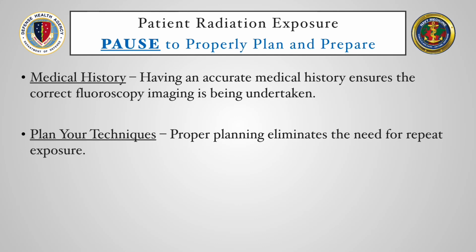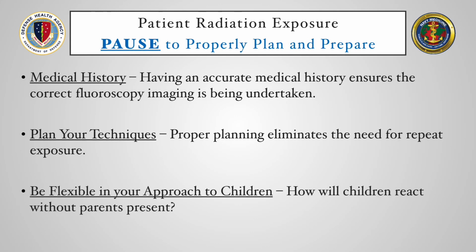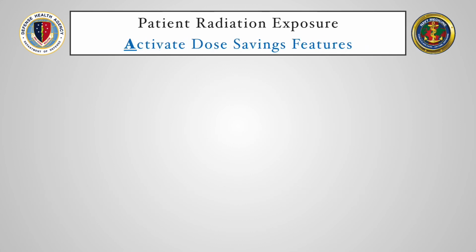Think through the following questions. Will there be a potential need for immobilization equipment? How will the child react if the parent's not in the room with the child? The responsibility rests on the equipment operators to optimize radiation dose, such that the radiation should consist of and not exceed the amount needed to capture a diagnostic study.